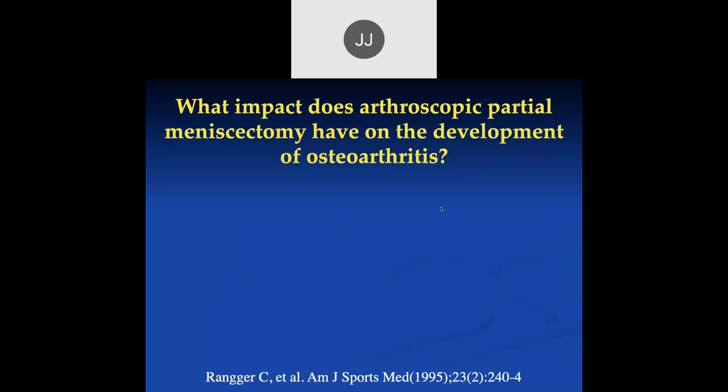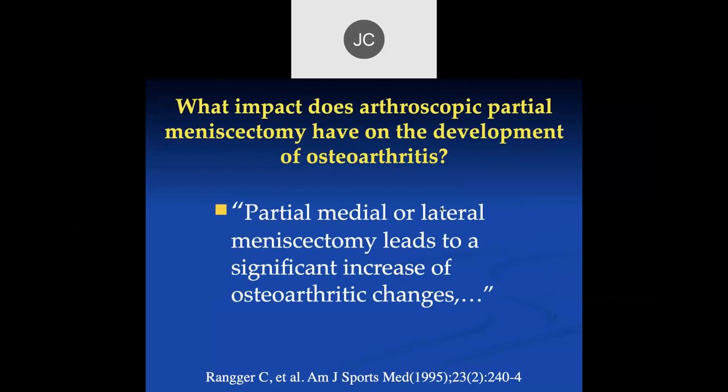Robert, what do you think? I think it would accelerate osteoarthritis and degenerative change. That was not thought to be the case for years. It was thought that the abnormal meniscus would cause increased trauma to the articular cartilage, and you'd get worse progression of degenerative disease. That's why it was a very common procedure. It was called a clean out, where you'd go in and remove the frayed edges of the articular cartilage and the menisci. This study found that if you do that, it leads to a significant increase in arthritic changes.